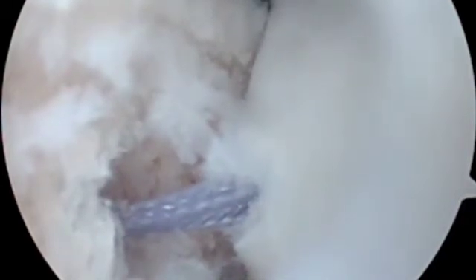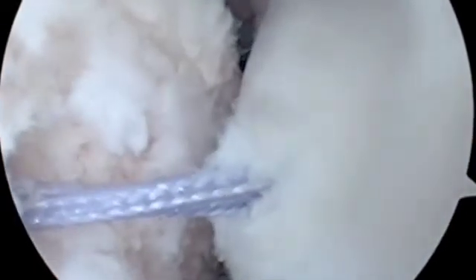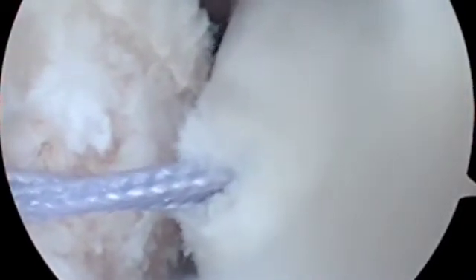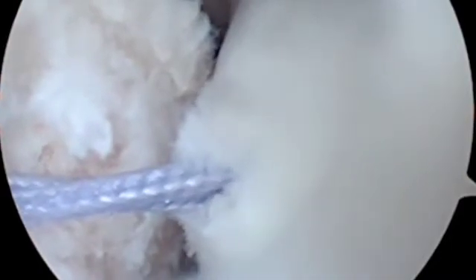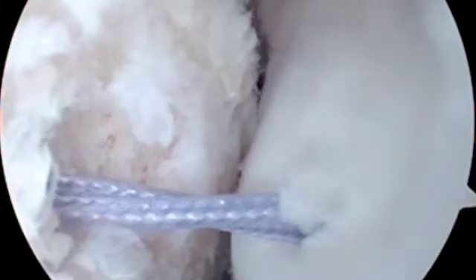One suture limb from the superior anchor is tied to a corresponding suture limb of the inferior suture anchor. This is repeated for the remaining two limbs so that a suture bridge is formed between the two anchors, which allows for compression of the infraspinatus tendon into the Hill-Sachs lesion.